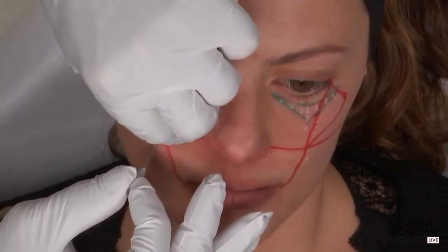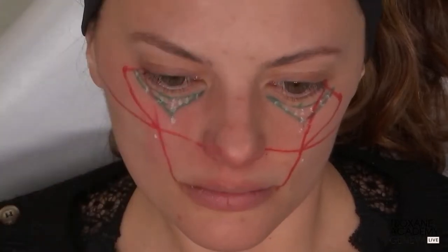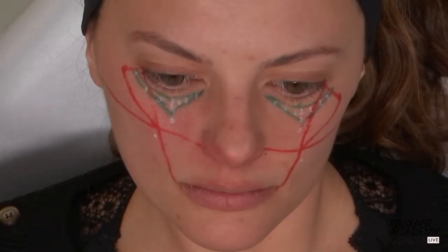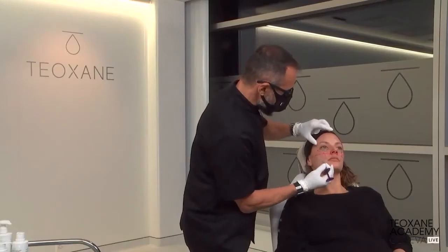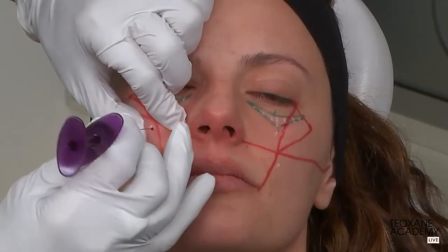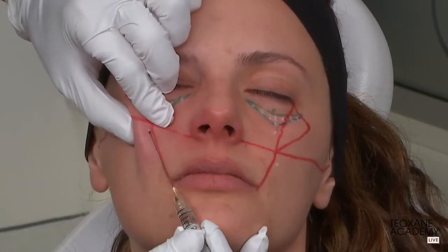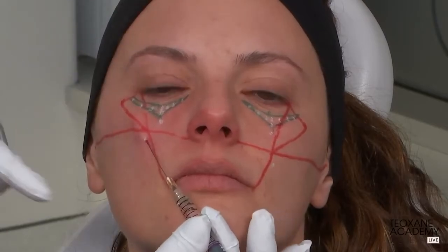There are many reasons, but the thing is most injectors tend to over-inject in the center, while the theory behind this, thanks to Gabriella's publication and Cotofana, and I was lucky enough to publish with them, we have demonstrated that by injecting lateral to the line of ligaments, you achieve an indirect effect on the nasolabial fold and a lifting effect that is long-lasting. So here is my entry point.